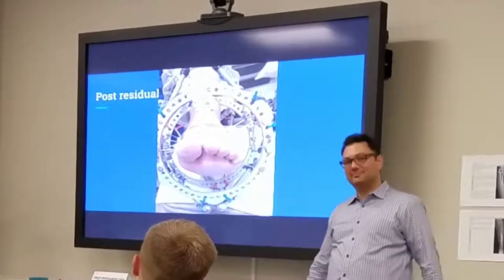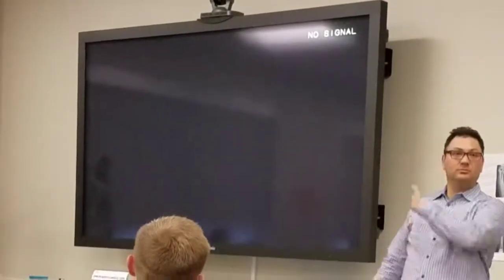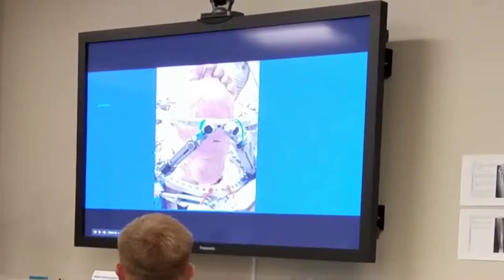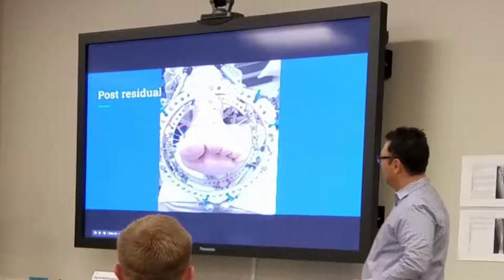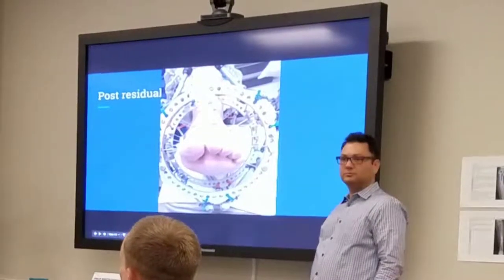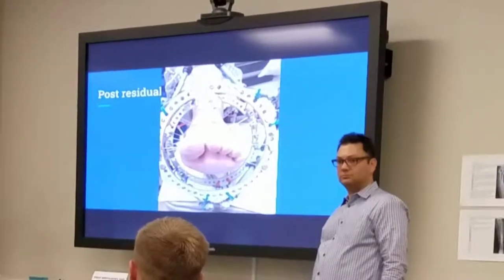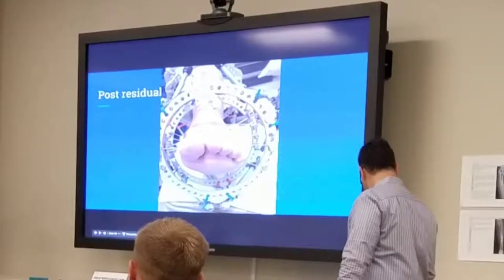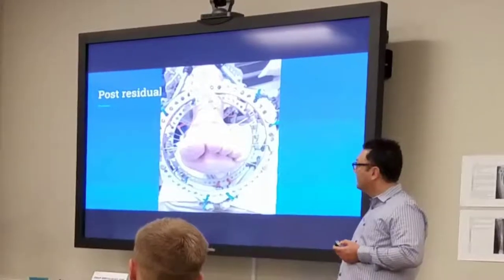For internal purposes, we've been trying to pull every one of those. As far as I'm aware, for the last 6 months, I don't have any reports about strut popping out. There was a little bit of a clearance issue with SRL, but they resolved this issue and it shouldn't be there. For those of you who have them with the surgeons, I'd suggest before going to surgery, just check whether it is that part number or another part number, so you can replace it if necessary. But it should be resolved, at least I haven't heard any problems.